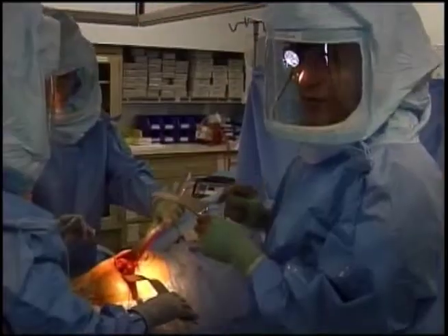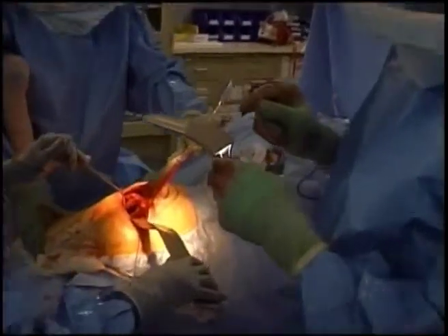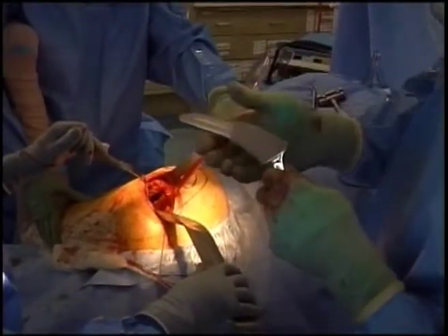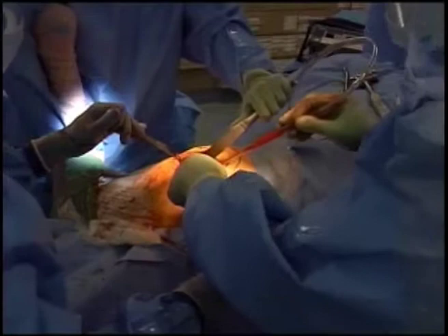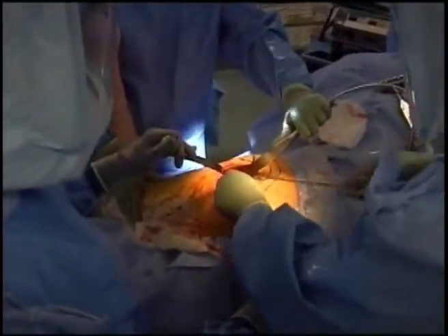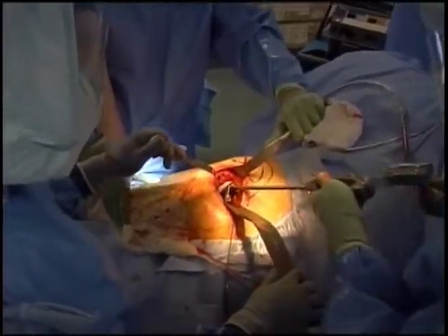This is the final stem, which goes into the thigh bone or femur. It's coated with titanium, just like the acetabular shell. Eventually the bone will grow against this titanium and lock the stem into the bone, making it part of the bone. It is impacted into the prepared thigh bone until it reaches a solid endpoint.